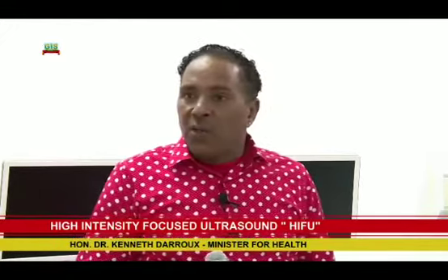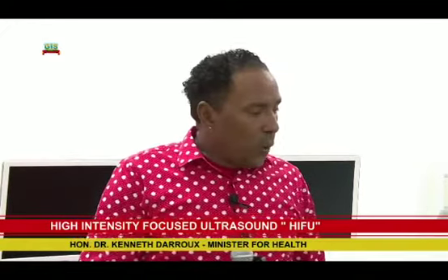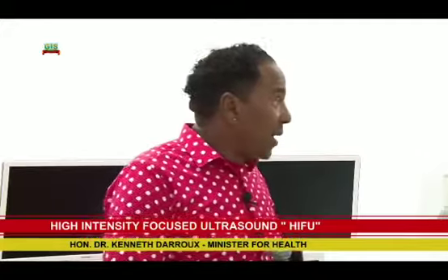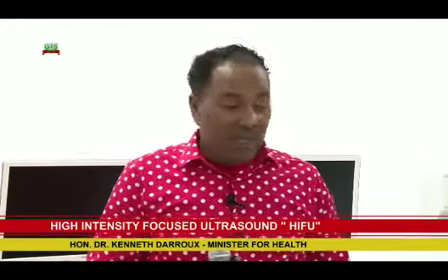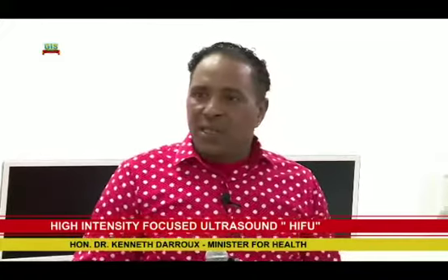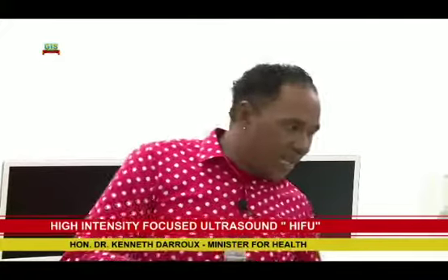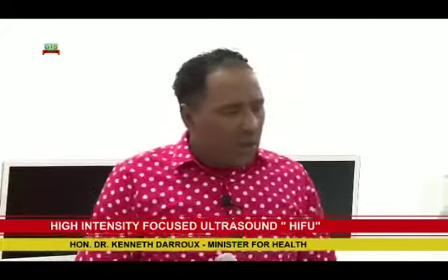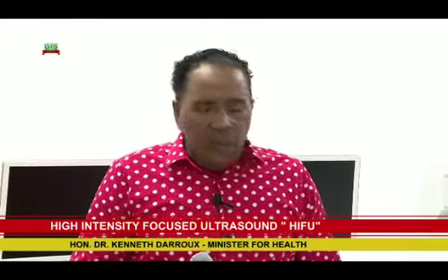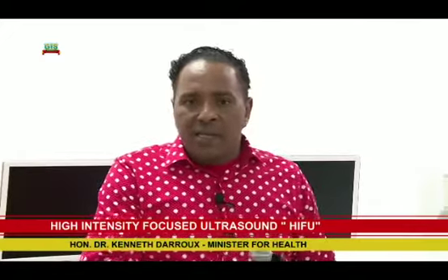We of course look forward to the commissioning of the hospital, where this service can now be available to the public, and in particular our men with prostate issues, both benign and of course malignant, meaning enlarged prostates that are not malignant, not cancerous, and even cancer tissues. I don't want to go out there saying that we have something to treat all cancers. It can only be used to treat what they call localized cancers, localized tumors.